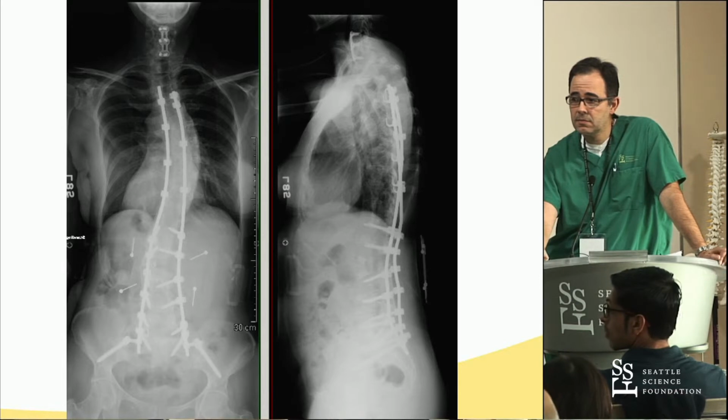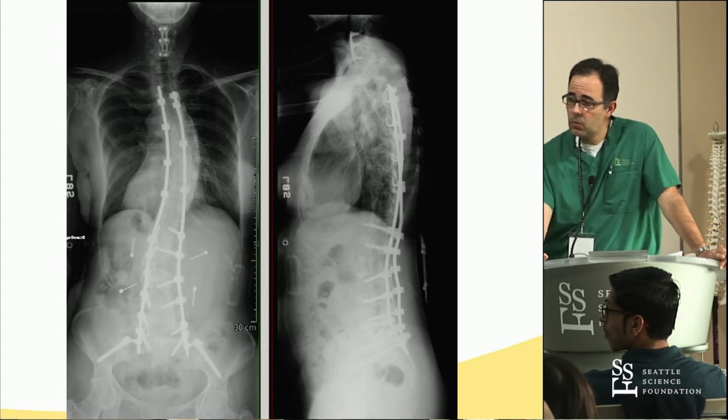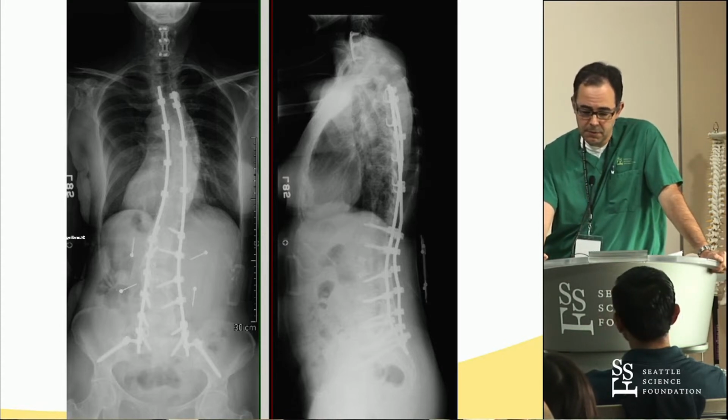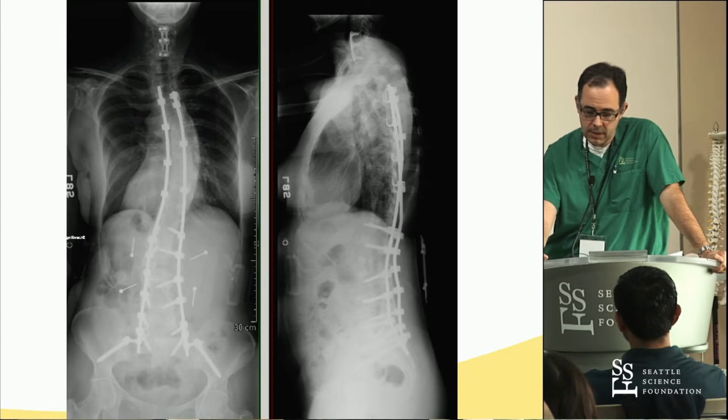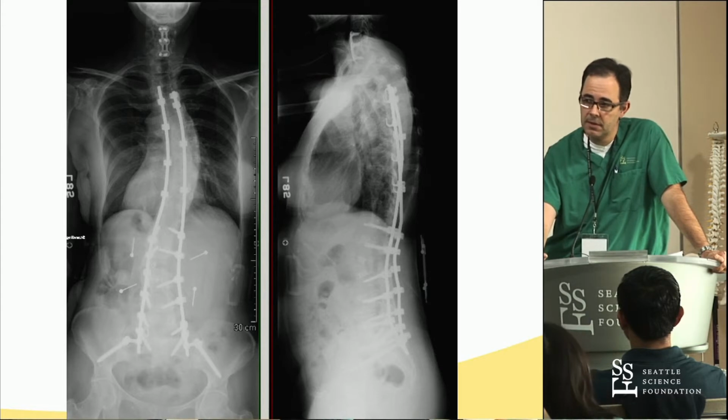Could you amplify on that? When you say you're putting in SI joint screws, what are you talking about? Something laterally across the SI joint? Right. So I don't know if you're familiar with the SI lock system from Globus, but it's a lateral trajectory similar to the SI bone trajectory. So they're iliosacral screws. Yeah. So that's what I've been using.